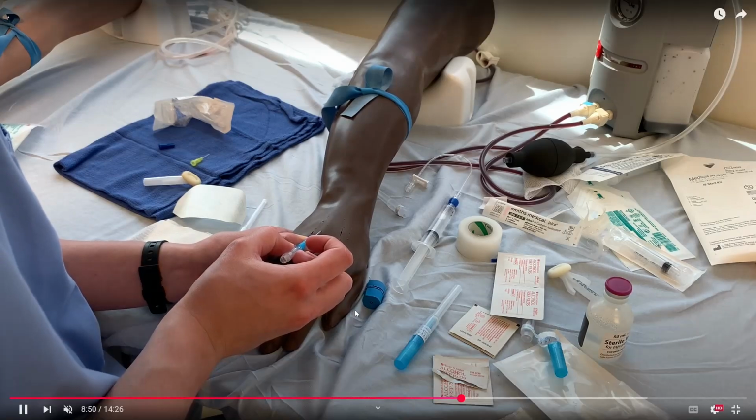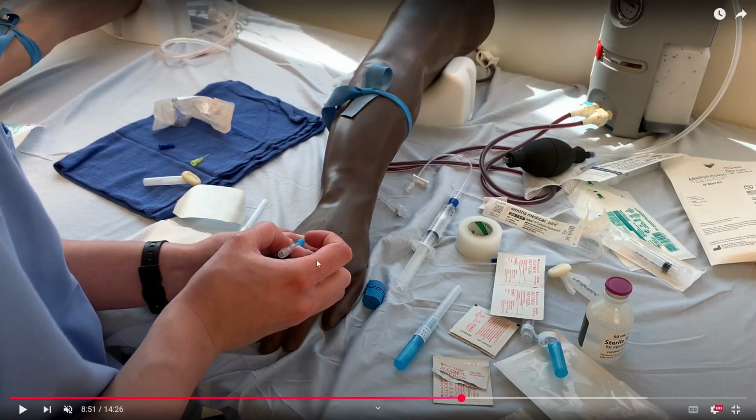So now here's what I want you to pay attention to, okay? You'll notice I have a free index finger. This is not pressing up against anything. I have my thumb and my middle finger holding the needle apparatus. Now what we're looking for is called flash. Flash is blood returning into this needle. So when we get into the vein, you'll notice blood is going to show up right here within this plastic. That's what I'm looking for, and that's what you should look for too.